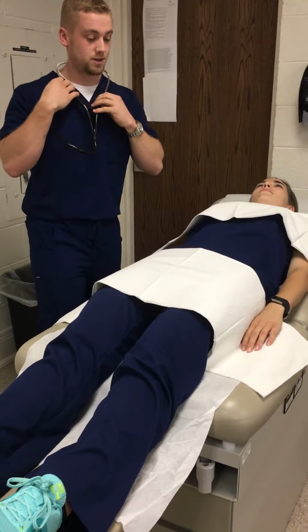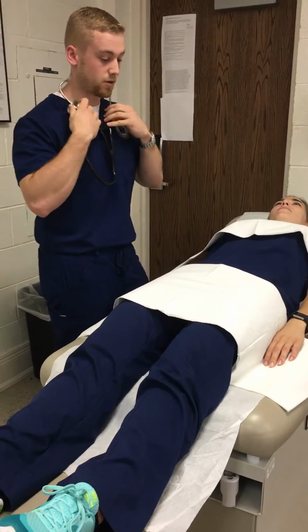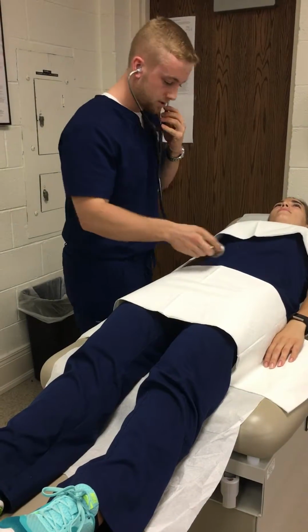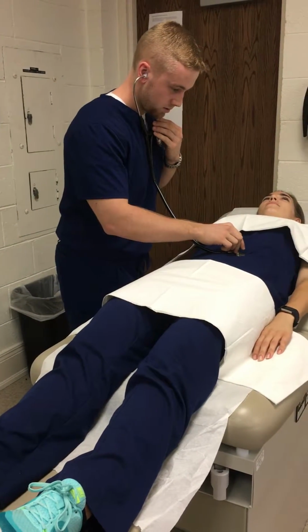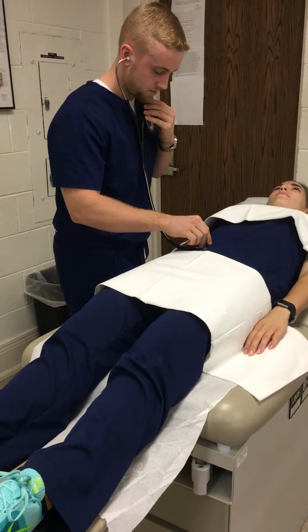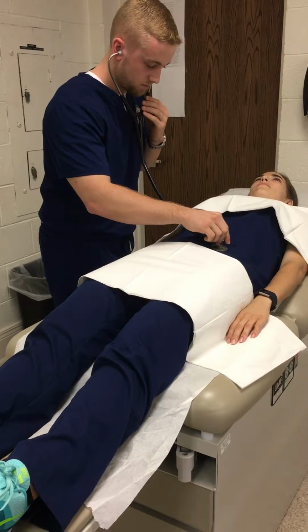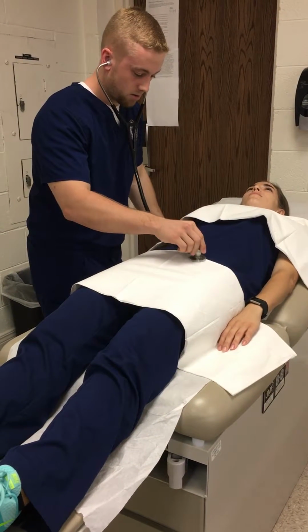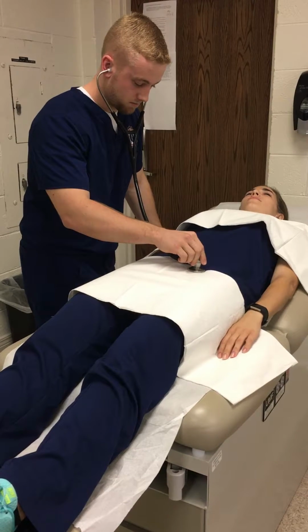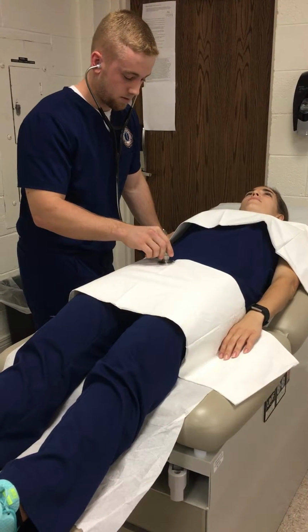Okay, now we're going to listen over all the vessels in the abdomen. So first we're going to listen over the aorta, and we're going to listen for bruits. Okay, now listen over the renal arteries. And the iliac arteries. And then the femoral arteries.